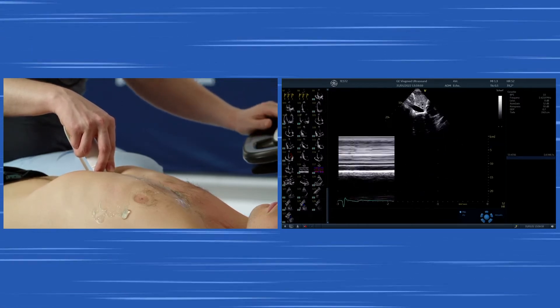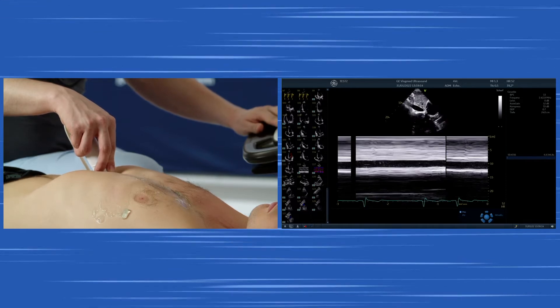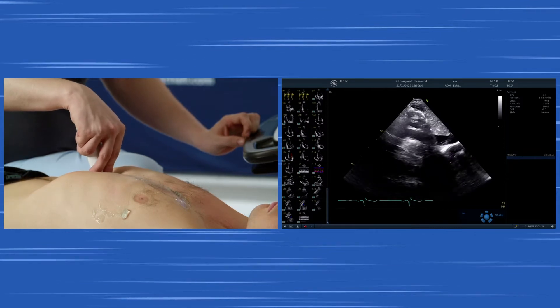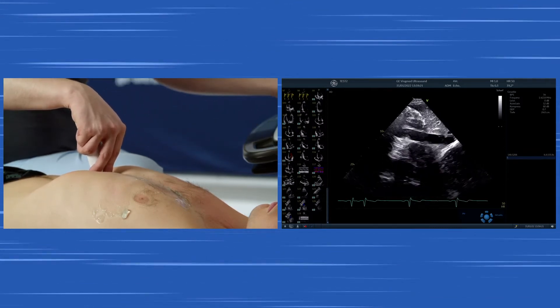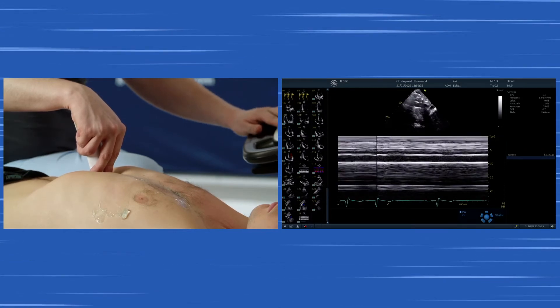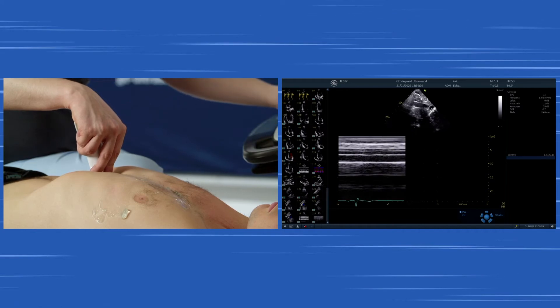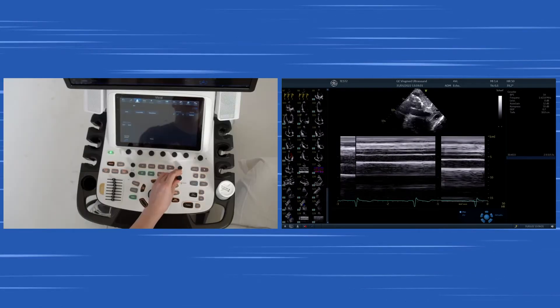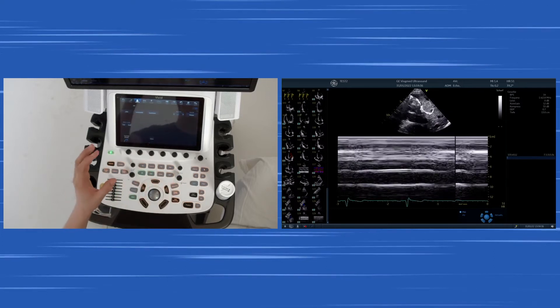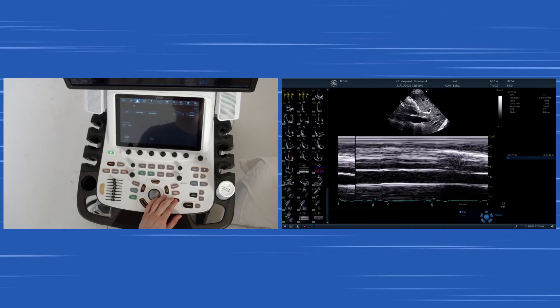To measure the IVC, we have several options. First, we can do it in a B-mode image. We can also use M-mode, where it's displayed how the IVC changes over time in regards to respiration. If the patient breathes, we see movement; if he doesn't breathe, we don't. We can also adjust the depth to visualize the IVC even closer. In M-mode, the IVC appears as the dark line in the center.